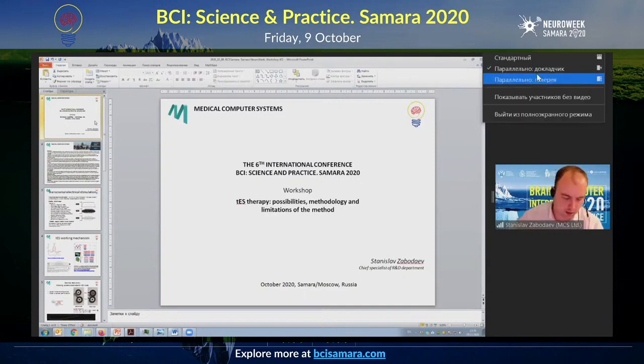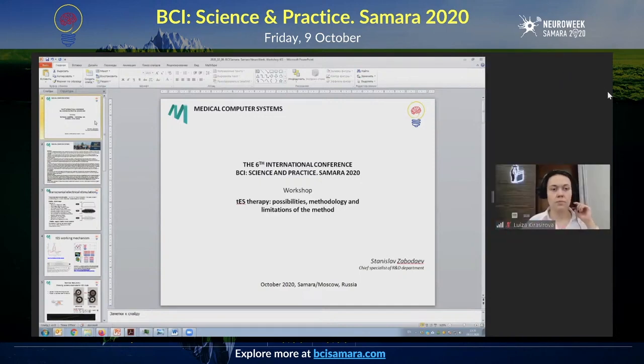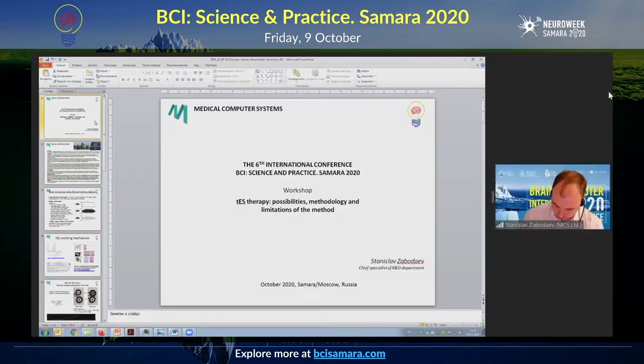In terms of certification, as I said, this specific device is designed for scientific research, and in the Russian Federation, if you work in an R&D institution, not a medical institution, by law you don't have to have such a certificate. We do not have such a medical certificate. If you want to use the device for medical purposes or therapy, you are not allowed to do that.